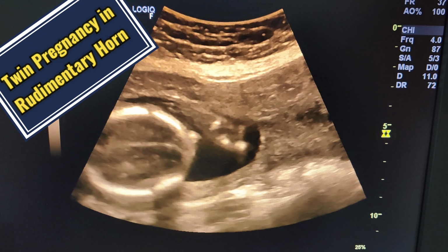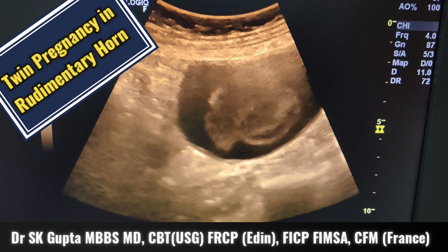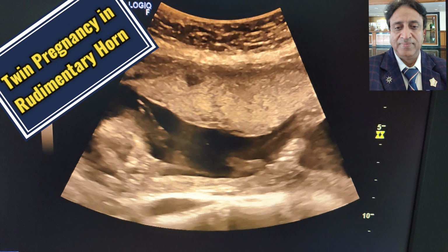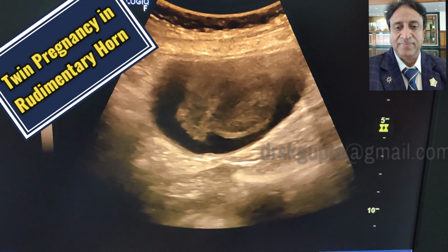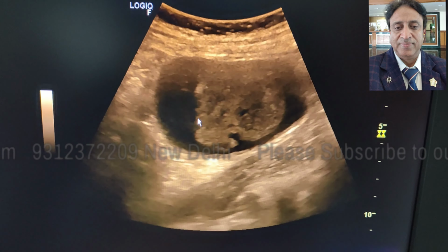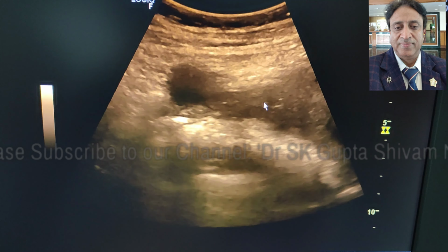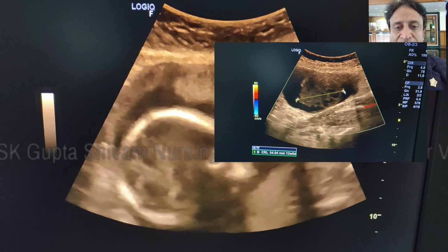Friends, I'm Dr. A.S.K. Gupta and I'm going to demonstrate to you a case of pregnancy in the rudimentary horn. You can see that there's a pregnancy of around 20 weeks of gestation, and if I tilt my probe towards the right flank of the patient, I see that there is another sac in which there is an amorphous fetus-like mass which is probably a demised fetus. It does not take up any color, and this is the pregnancy in the rudimentary horn of the uterus.